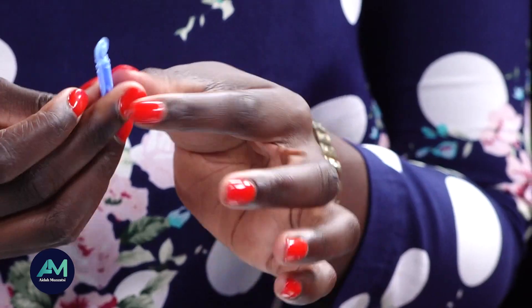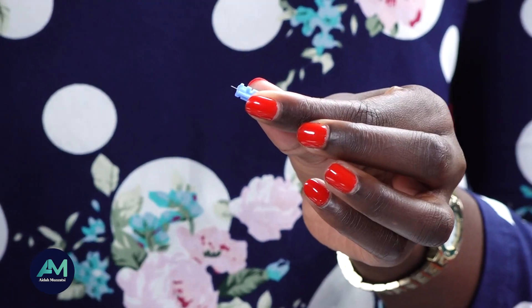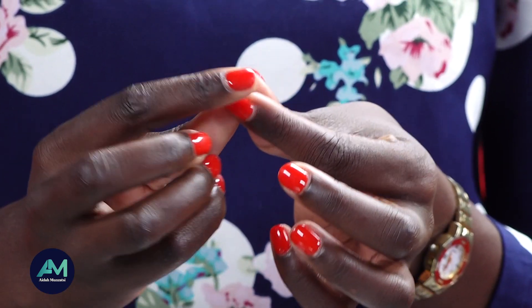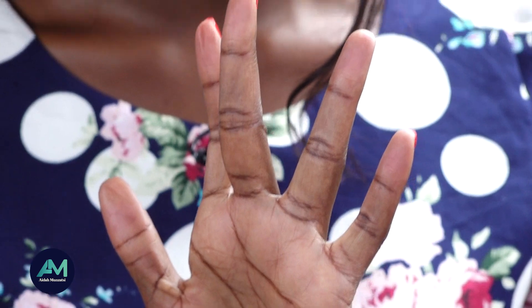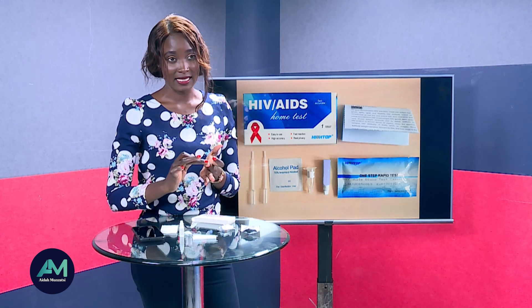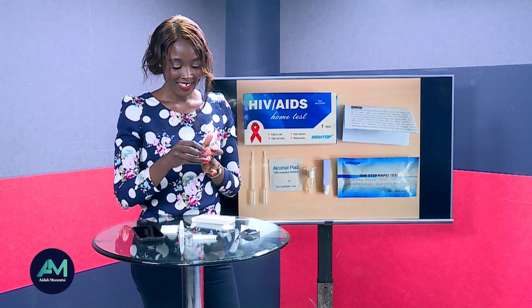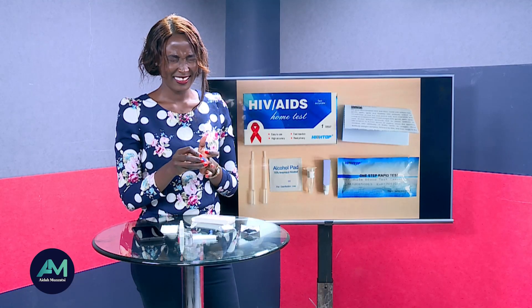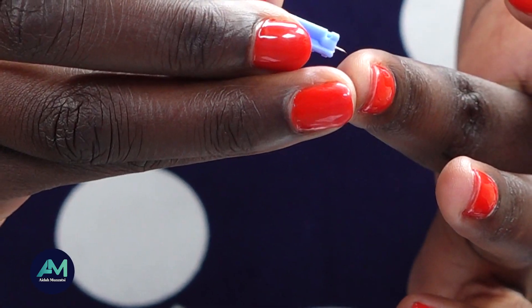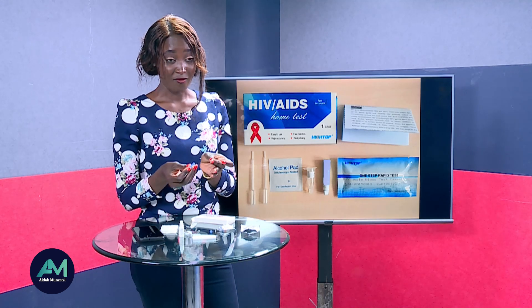Take the lancet — you'll need to turn it twice to open it, so turn one, two. Then pull it. Now on the middle finger, prick yourself to get the blood sample. I've been able to prick myself, and we put the lancet aside.